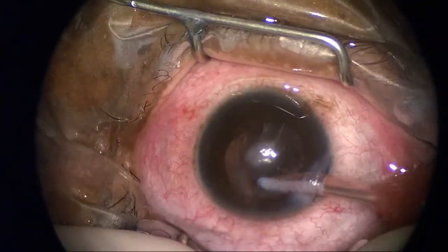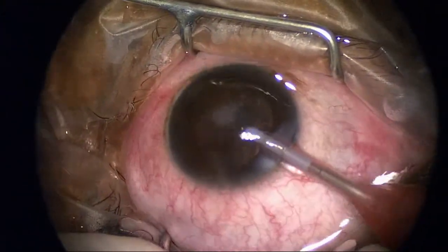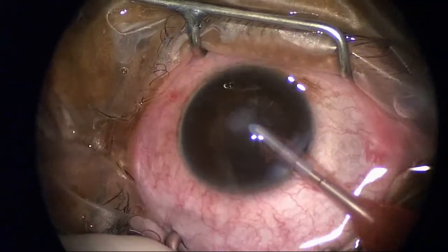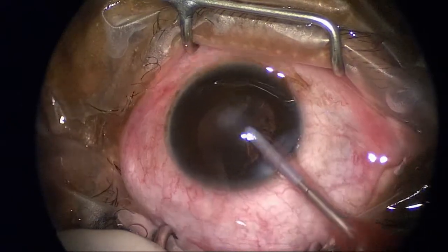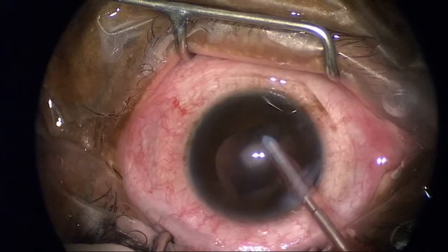I'll remove that central area at the end. If my visibility was restricted I'd have removed it earlier; however, I'll take that out at the end in an effort to reduce the risk of having loose epithelium around and the risk of epithelial downgrowth.